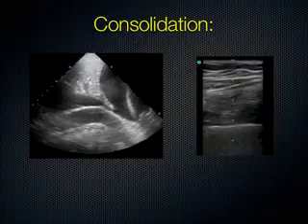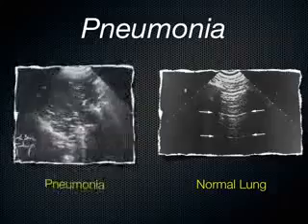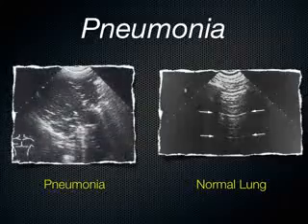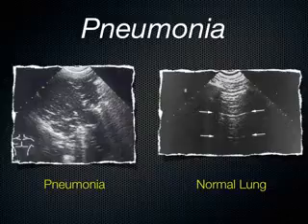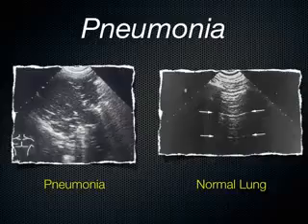like a solid organ. So if you go in all 8 of your quadrants, basically, quadrant on both sides, you might be able to even say this is a right upper lobe infiltrate and compare that with your chest x-ray, because not everybody has full pneumonia on both sides, and it's a good thing. You might have one lobe affected on either side, and you can start to hone your skills by trying to find it and then comparing it to the chest x-ray.